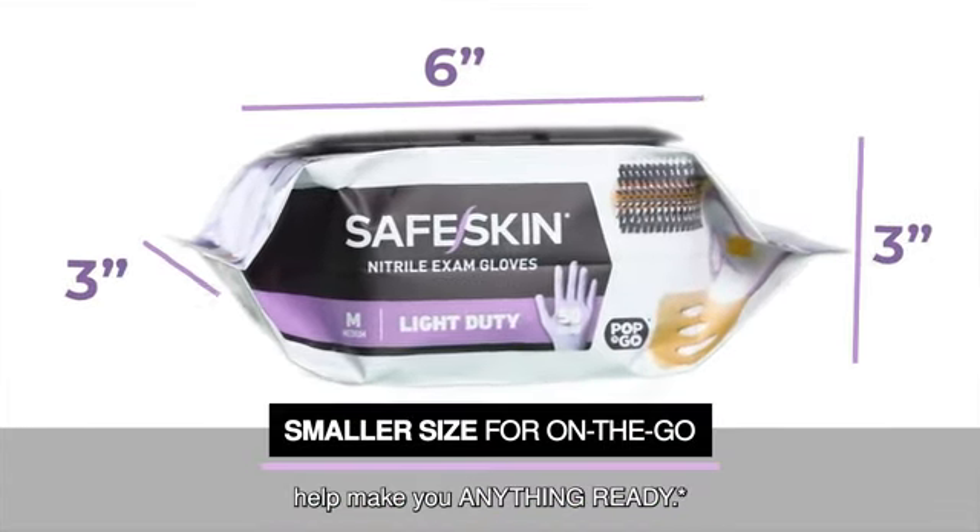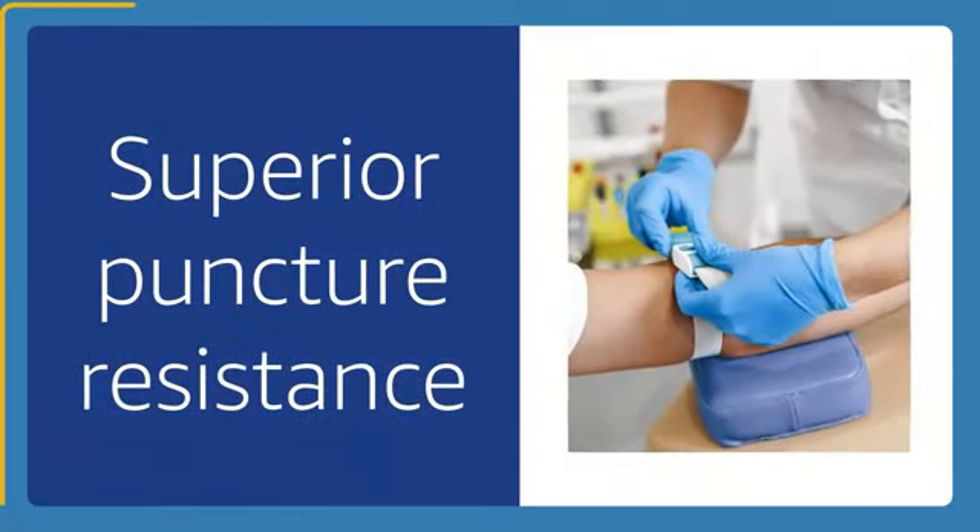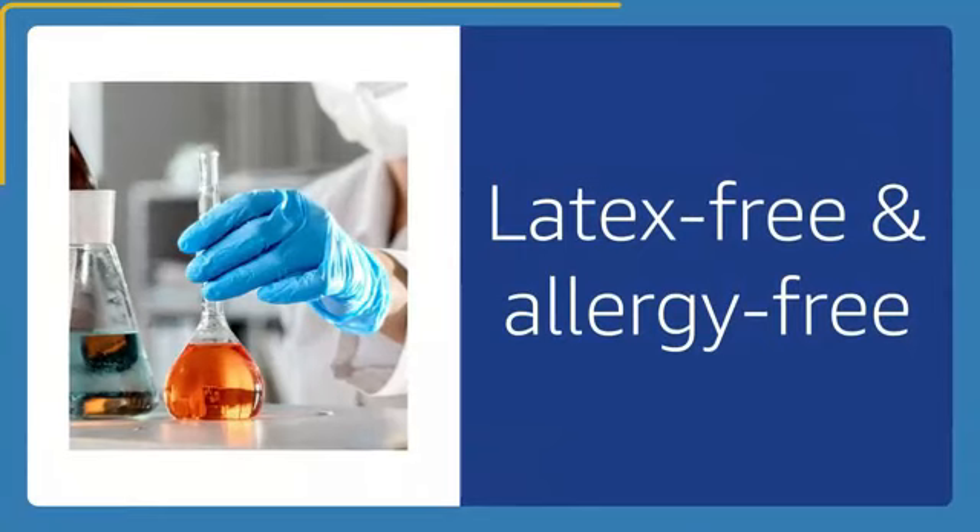The care instructions emphasize the importance of proper cleaning to maintain the glove's integrity and ensure safe usage.